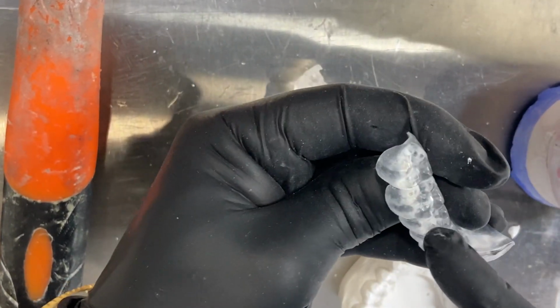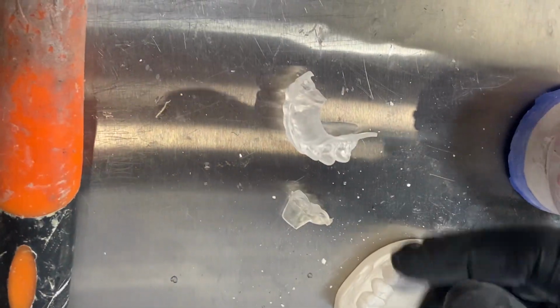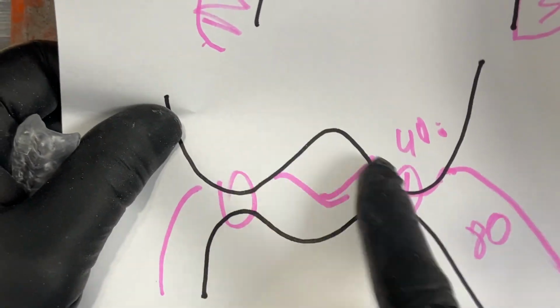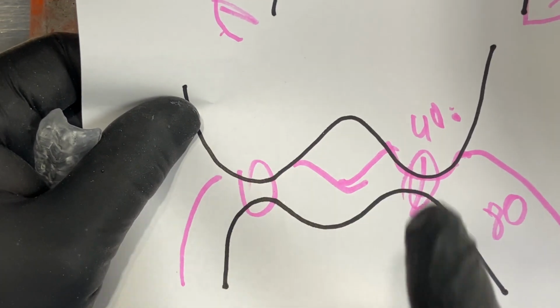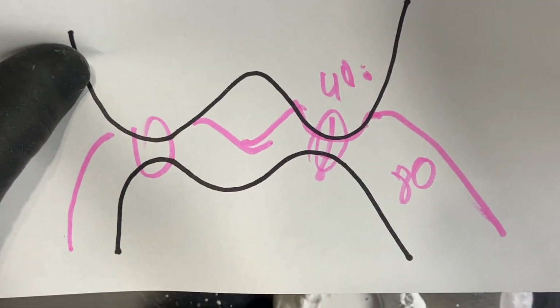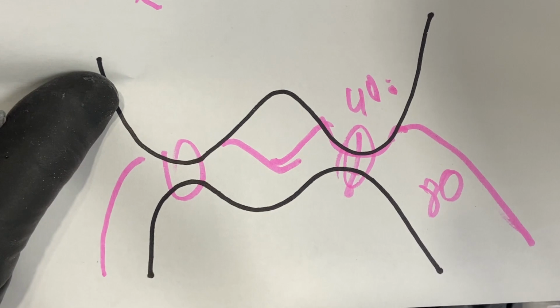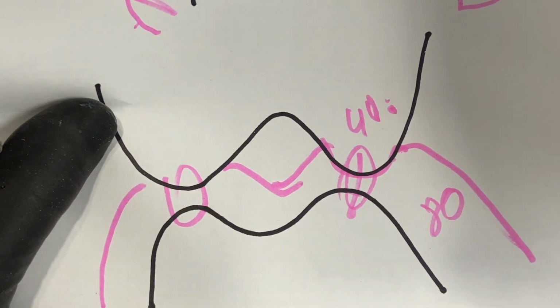And since we have a central groove that is most of the time thinner, and most likely in cases with these crossbites that create areas with less space, it will be an easier way to break.